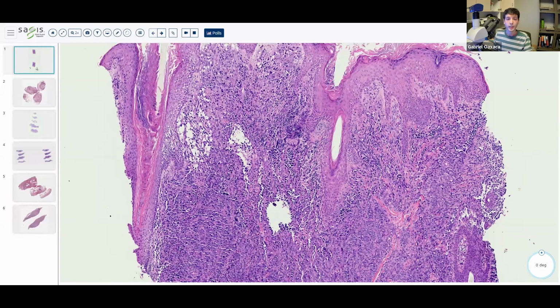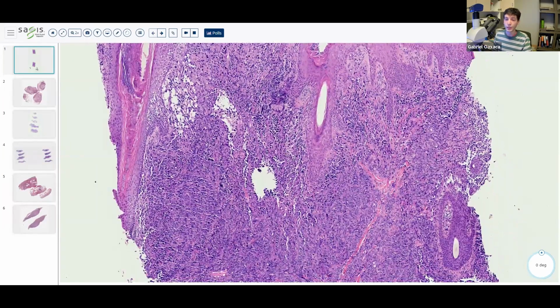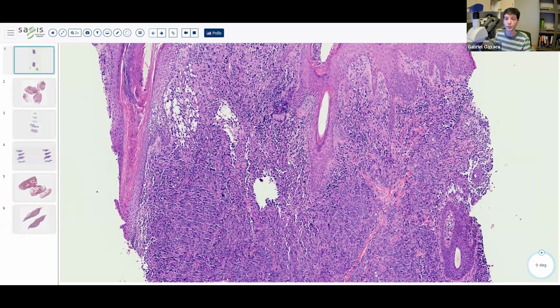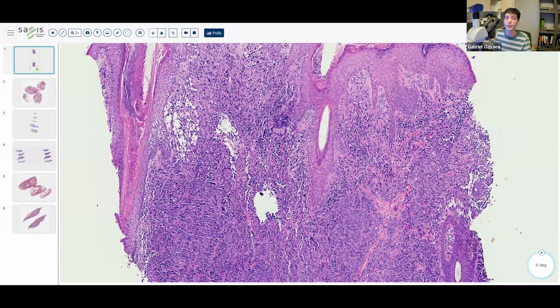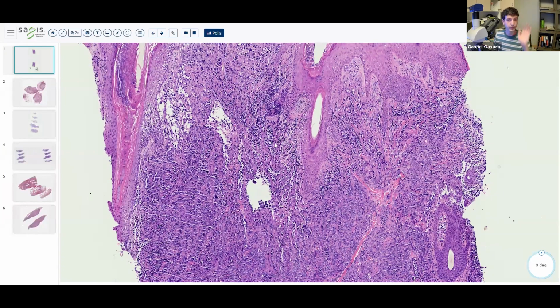So for the lymphedema and chronic radiation associated angiosarcoma, those are interesting in that there's an additional immunohistochemical stain that one can perform and cinch the diagnosis with, and that is c-MYC. I do believe that is a pretty important thing to remember. So radiation and lymphedema associated angiosarcoma stains with c-MYC, and they have c-MYC amplification on molecular analysis.